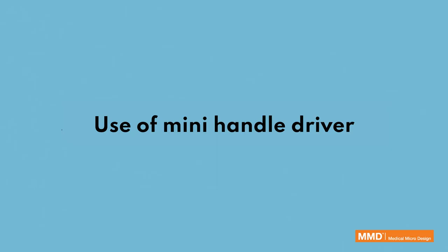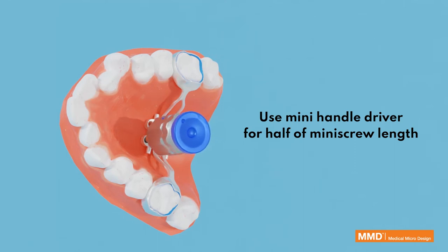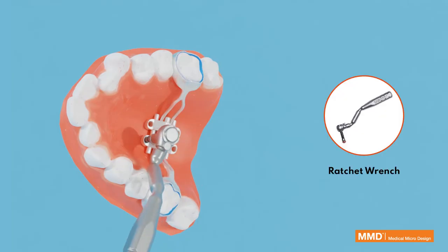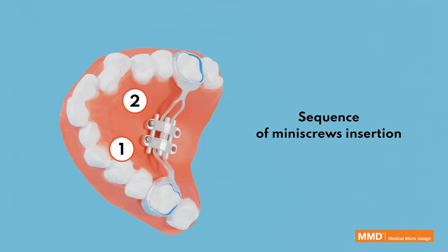Use mini-handle driver for half of miniscrew length. Finish miniscrew insertion with ratchet wrench. Sequence of miniscrews insertion.